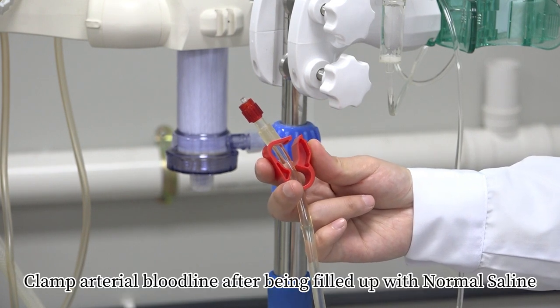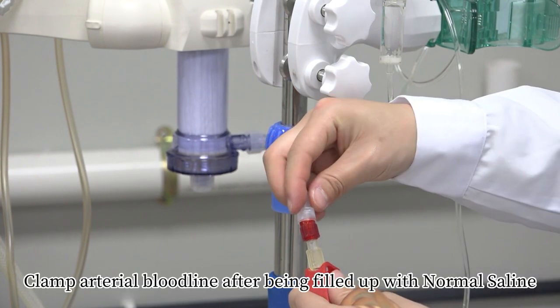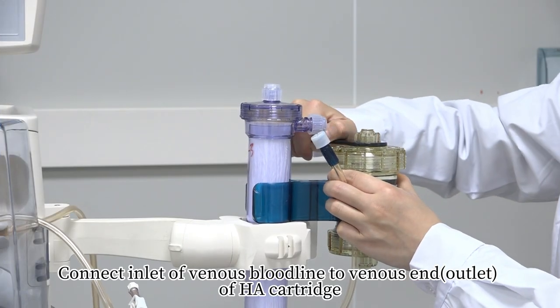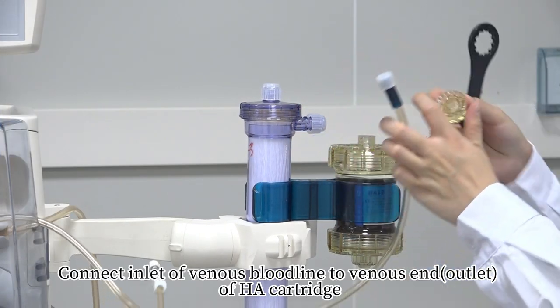Clamp arterial bloodline after it has been filled up with normal saline. Connect inlet of venous bloodline to venous end of HA cartridge.